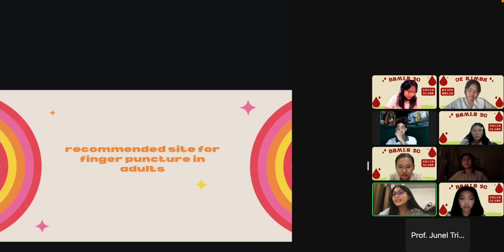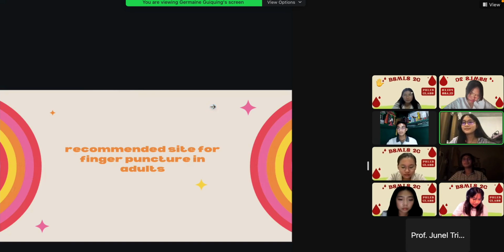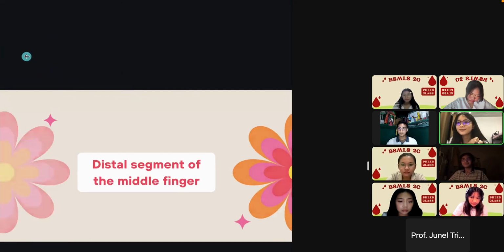Now, our next case. What is the recommended site for finger puncture in adults? Anyone? Okay, Miss Zhyra? Distal segment of the middle finger po. Okay, let's see if Miss Zhyra is correct. Very good.